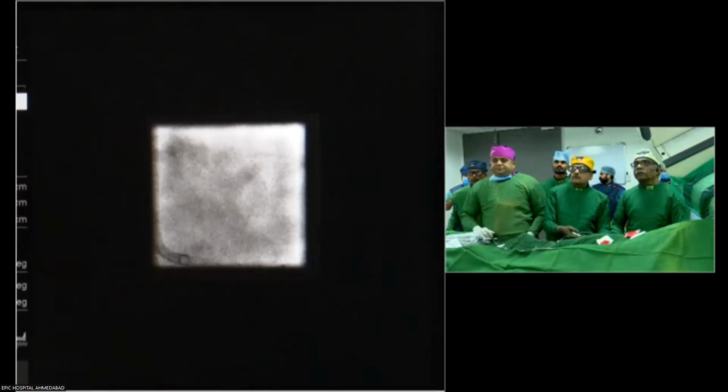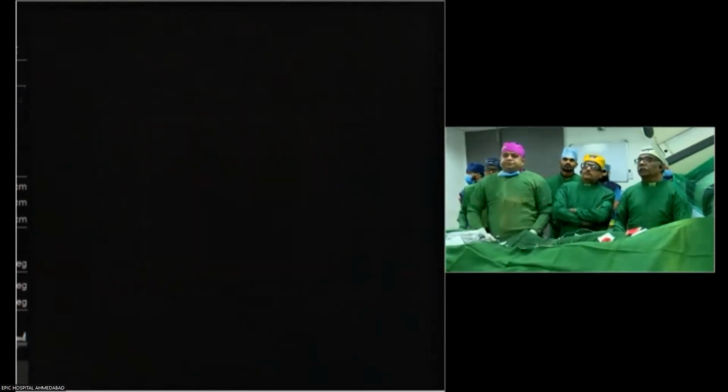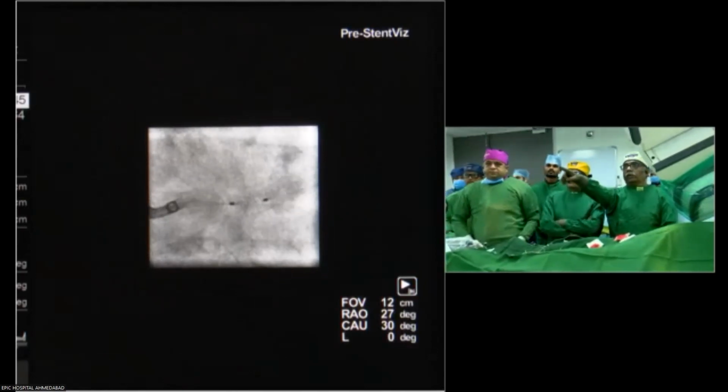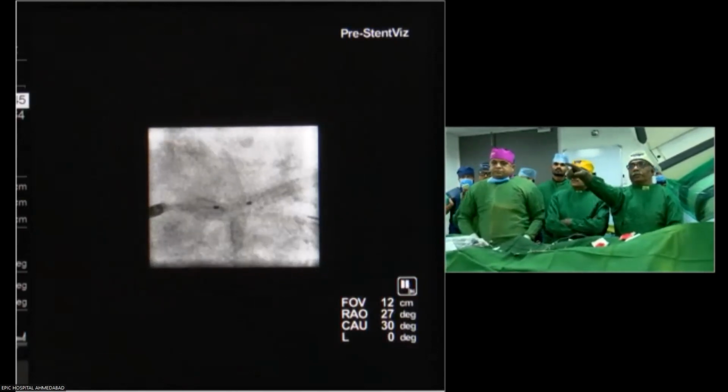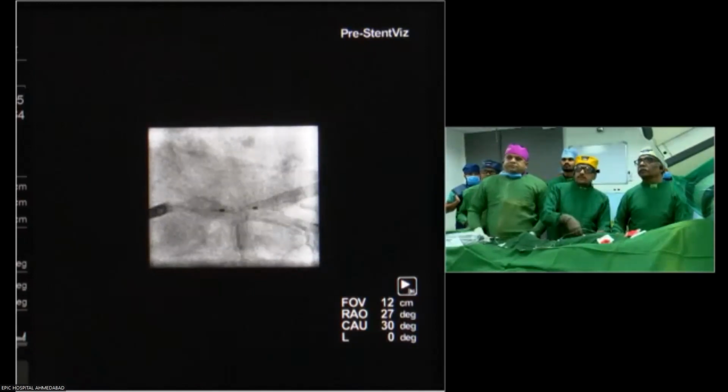So in the screen, can you focus the stent boost on the screen, somebody? Not this screen, the second screen, not the monitor screen. Let us push more, you may be coming into the left main. Yeah, I think so. Yes, we are pushing the balloon inside.